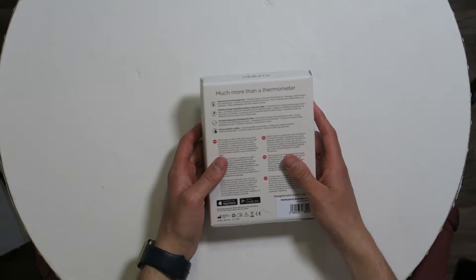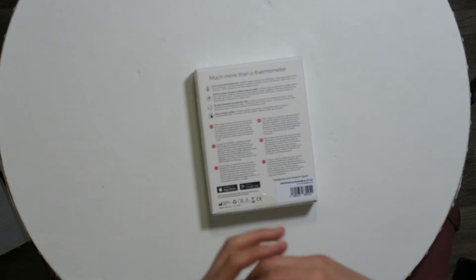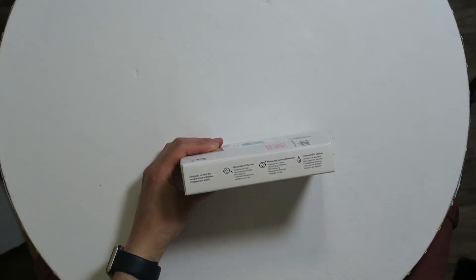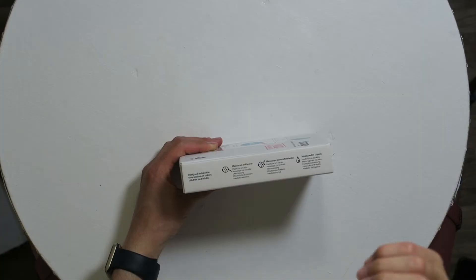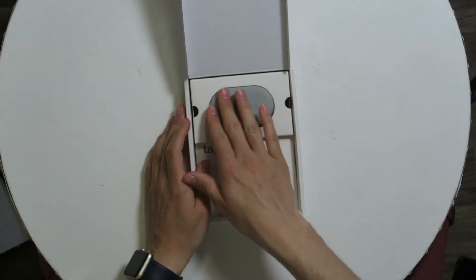On the back it says: quick and accurate temperature, medicine dosage advice according to age and weight provided, temperature development online, and shares patient profiles. It has an app for Android and iOS, and with the app you can calculate medicine doses, get notifications to take your medicine, measure in the ear, measure across the forehead, and also measure liquids — like a milk bottle for a baby.